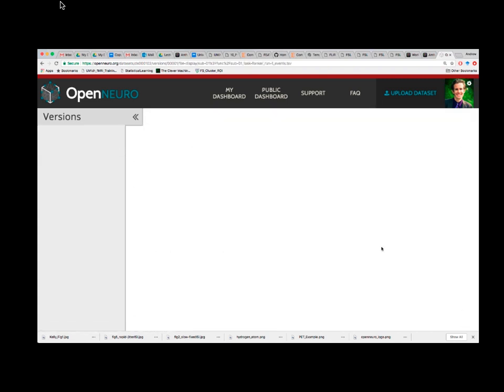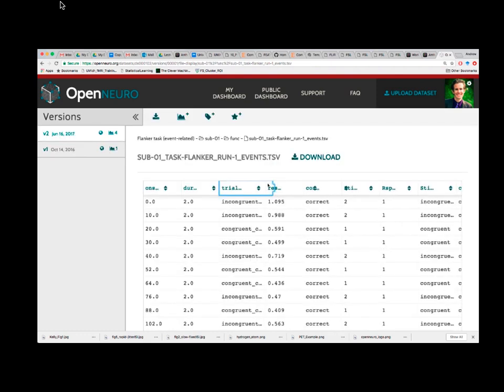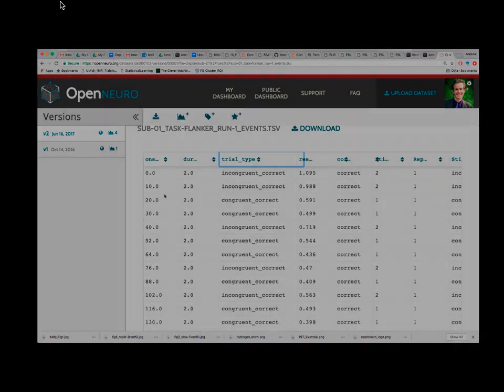I don't know if you can read that, but there's the actual neuroimaging data, and there's the events file. Within that, we have information about the onset in seconds from the beginning of the scan when a certain trial of a certain condition occurred. So there's incongruent, congruent. There's also information about whether they made a correct or incorrect response. From what I've seen, they're basically almost at ceiling, so I'm just collapsing all incongruent, all congruent.